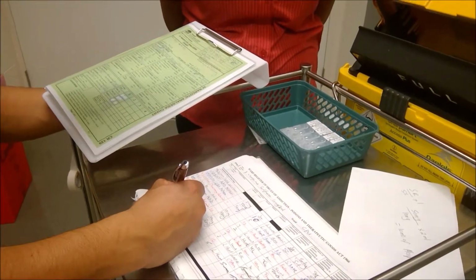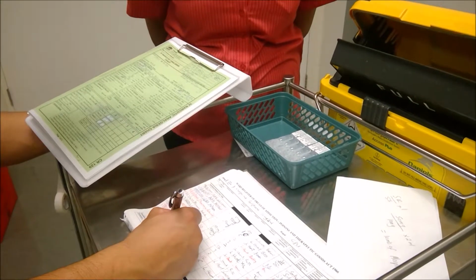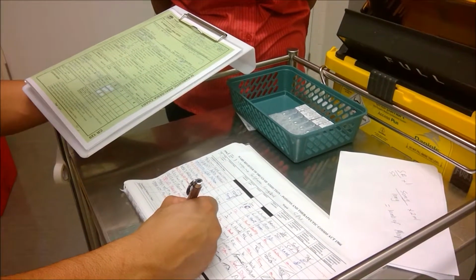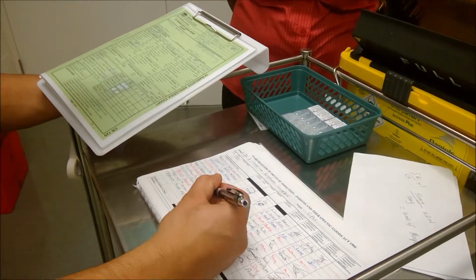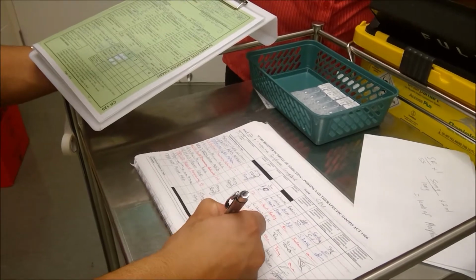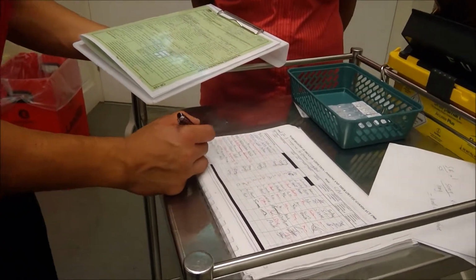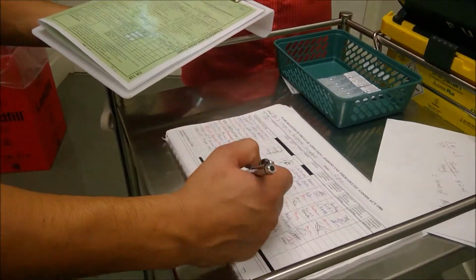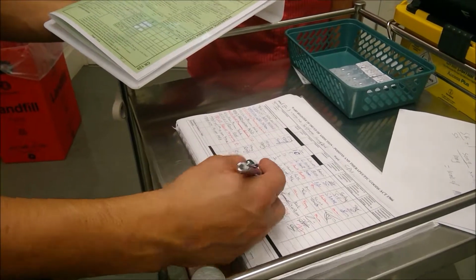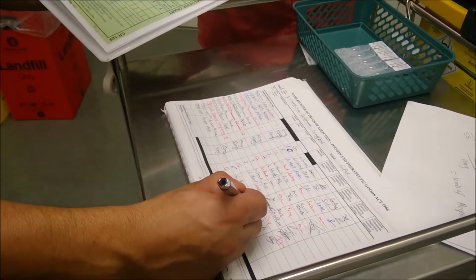And then we'll move on to this. I'll do this one, but I'll just discuss the PCA and start with my... Okay, so I've signed the date and the time and the patient's name, as well as the amount we're going to be giving and the balance and the name of the prescriber. I'll be writing my name now, and I'll need to get your name and signature after.